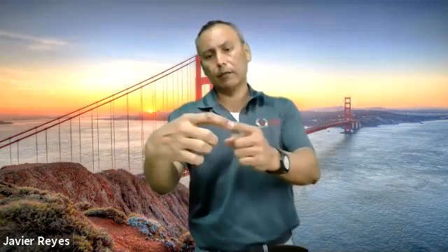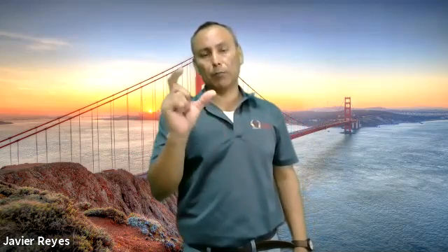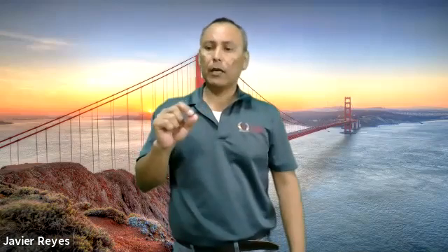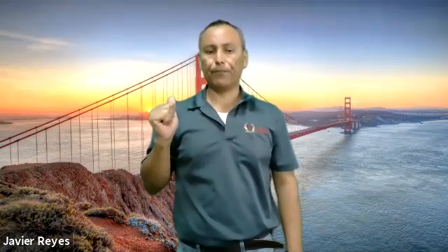So after you collect your specimen, you put the label on the tube and you ask them, is this you? And the patient will say, yeah, they look at this, oh yeah, that's my name, yeah. So you verified them, okay? They've spoken, their ID band, and now you're showing them their tube. It's part of the identification process, guys. If you can do this every single time, you will never have any problems. But if you forget, or you're in such a hurry, you say, I'm going to go ahead and label it outside. Things can happen. All right, things happen.